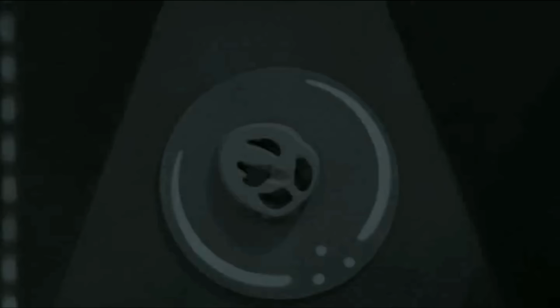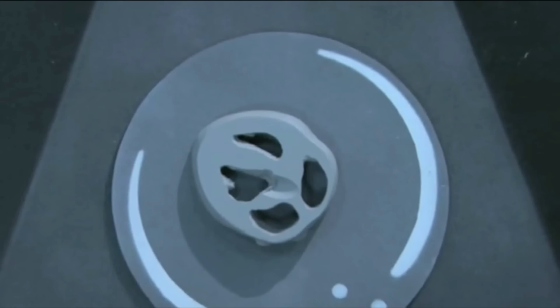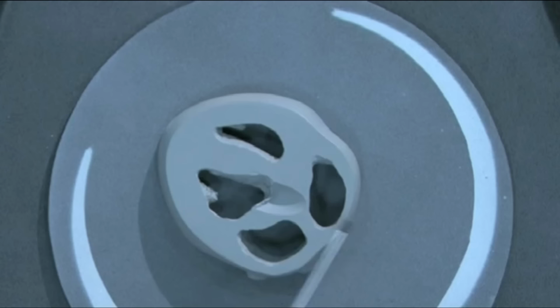When you move up from the four-chamber view, again remember it's only a tiny movement of the probe, a couple of degrees. You sneak up to the aortic outflow, and then you find the reason, if you like, for the atrioventricular septum. The aortic outflow appears just above the atrioventricular septum. When the baby's in this position, you'll get a pretty good view of the aortic outflow because it's running perpendicular, more or less from left to right across the chest.